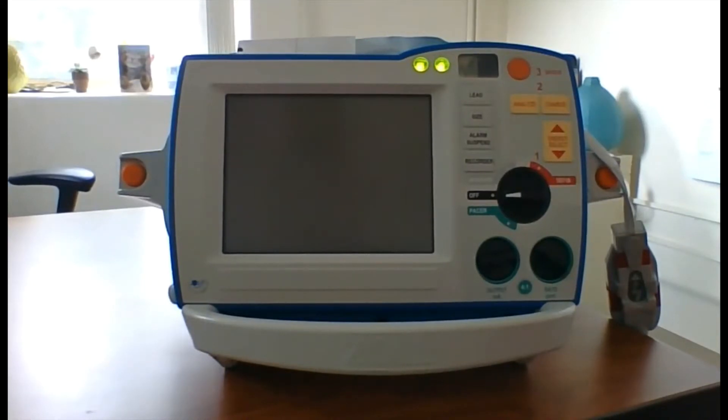This video will demonstrate how to perform the weekly defib checks for the Zoll R Series Plus and ALS models. The checks for the R Series Plus model are the same as what will be shown here on the ALS model, with one exception: the R Series Plus model must first be put into manual mode before performing these checks.